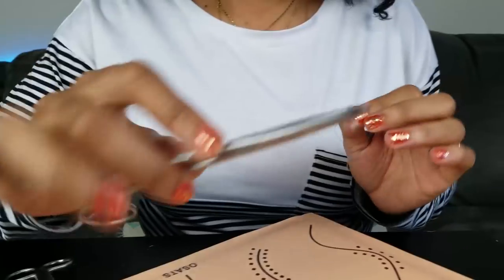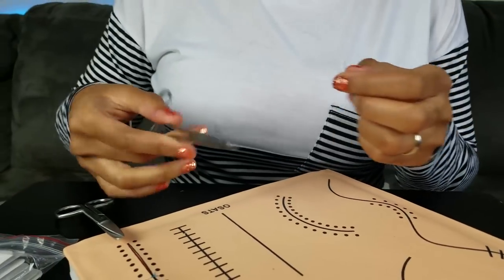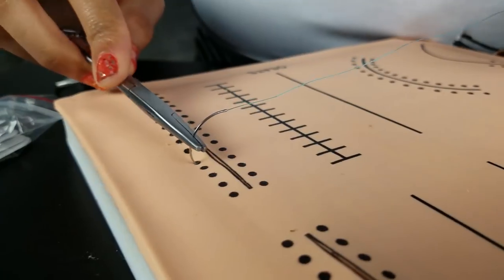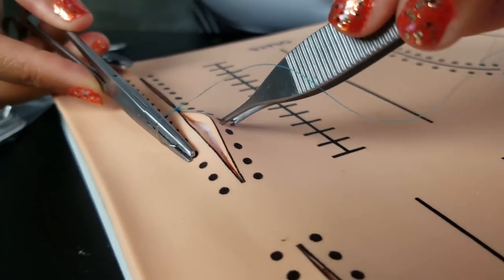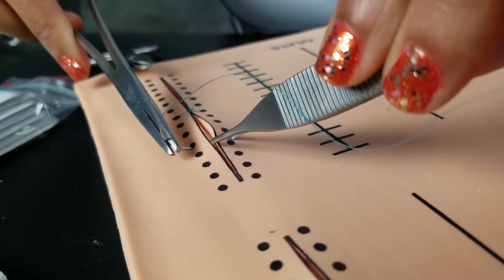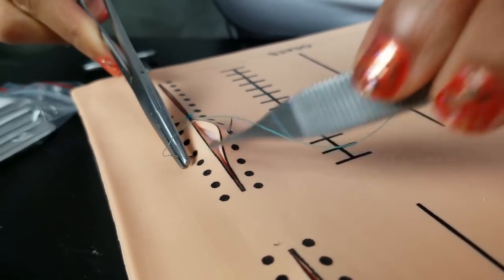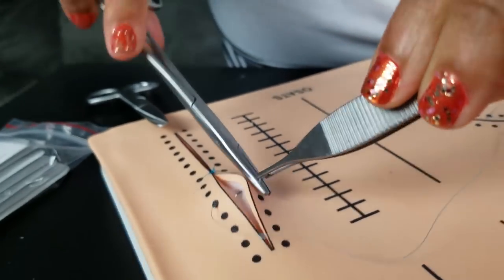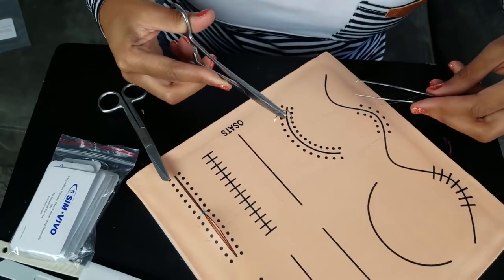So again, we hold it. This is what we've learned. You don't really hold it like this to go in. You hold it like this. Go in at 90 degrees. I'm going in the middle because you have to put that hole in there. All right, and then I can release it. And there it is, coming through. Needle holder. Pull it out. All right, that was a little better.